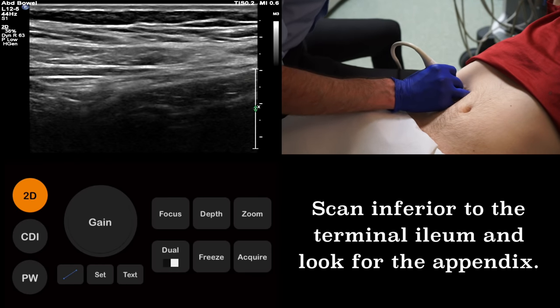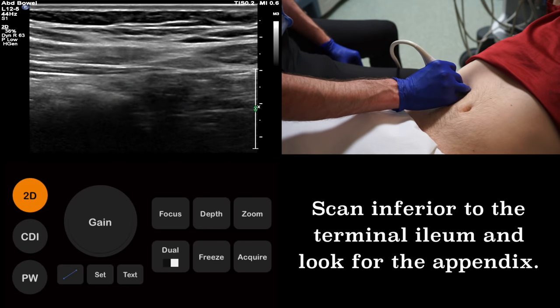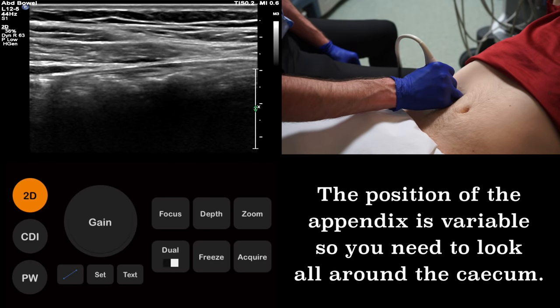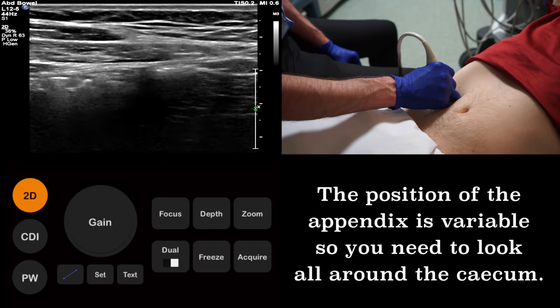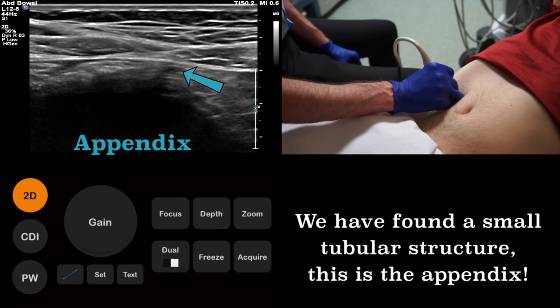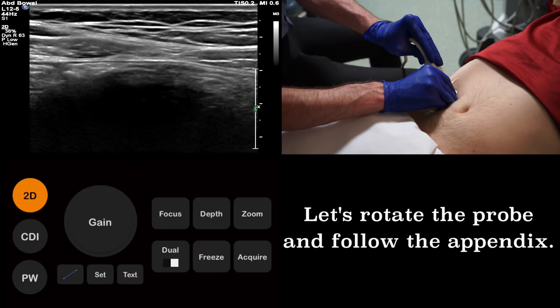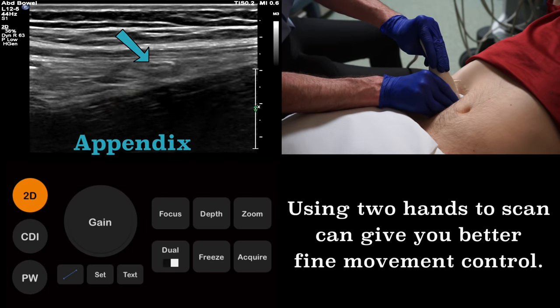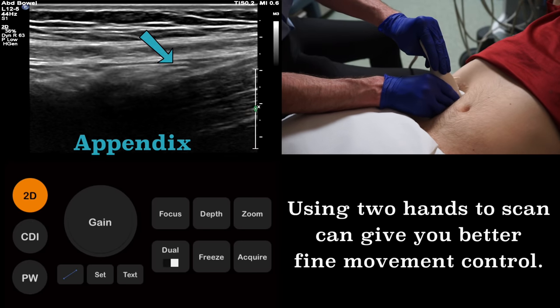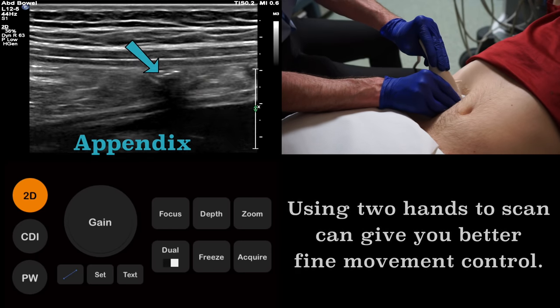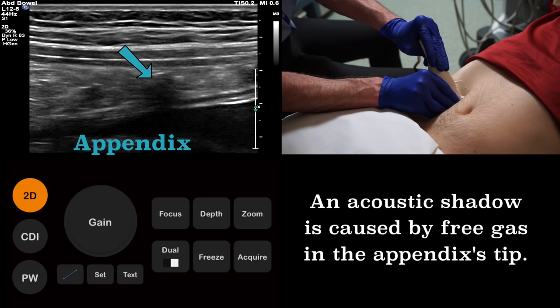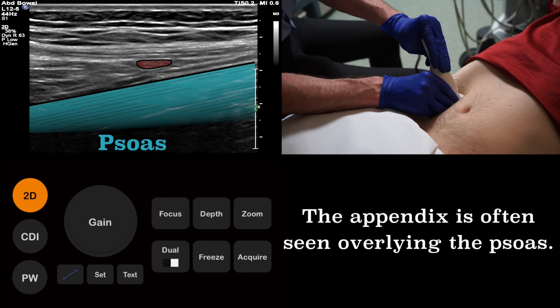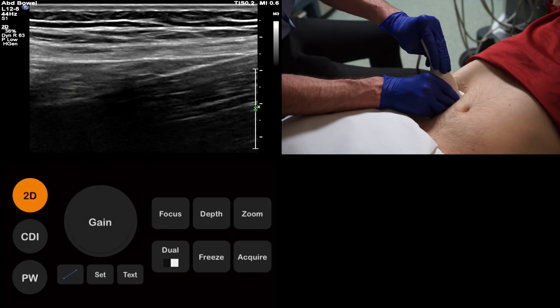Look carefully for a small blind-ending tubular structure. The position of the appendix varies from person to person, and therefore you need to look all around the cecum to be sure of finding it. Having found the appendix, we must now image it in its entirety. As the appendix is small, using two hands for fine movement control is a useful strategy. At the tip of this appendix, we can see acoustic shadowing, as there is some gas trapped within it. A useful anatomical landmark is the psoas muscle. The appendix will often be seen overlying this structure.